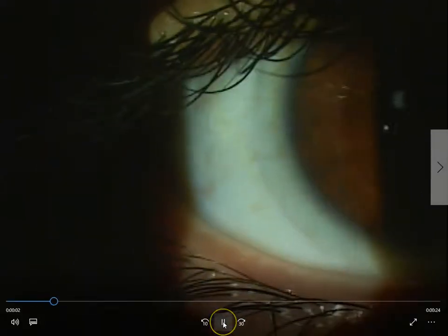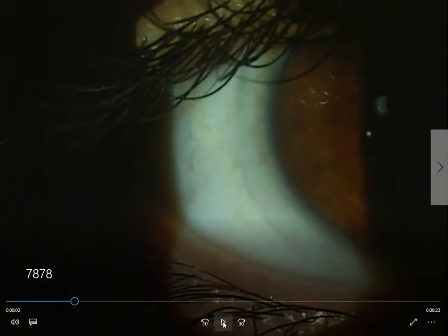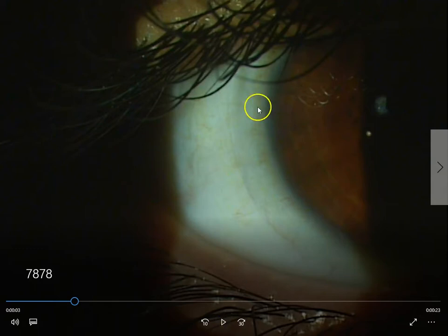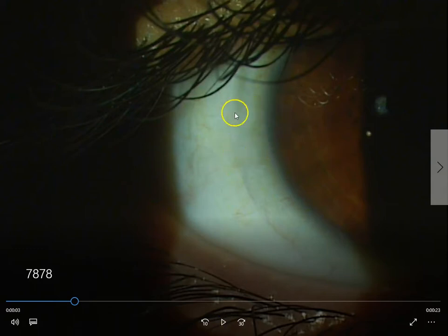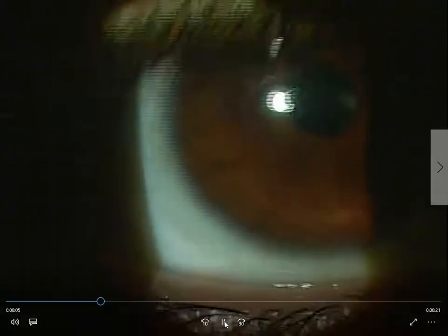This is a contact lens in the eye, and you can see the contact lens. One of the things that we look at is the space between the contact lens and the eye — it has to be equal on both sides.